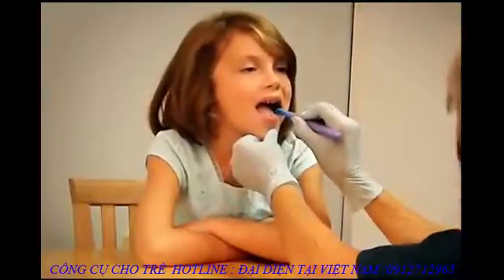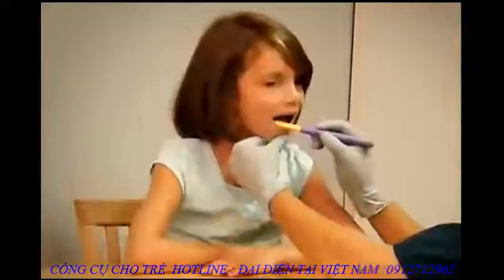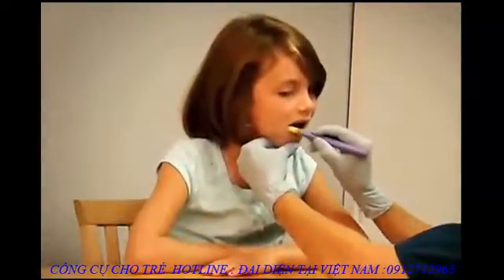The softer brush tip has pliable bristles which allow for gentle gum massage and teeth cleaning. The harder brush tip can be used as a transition to the eventual use of a regular toothbrush.